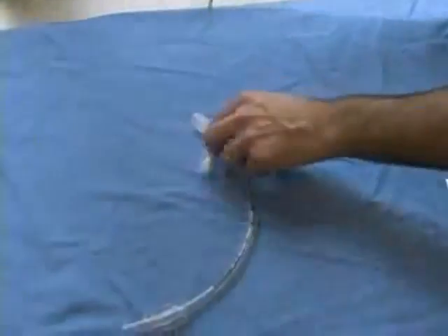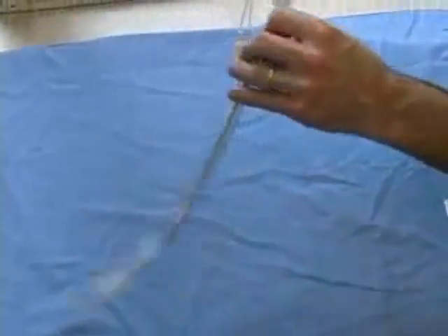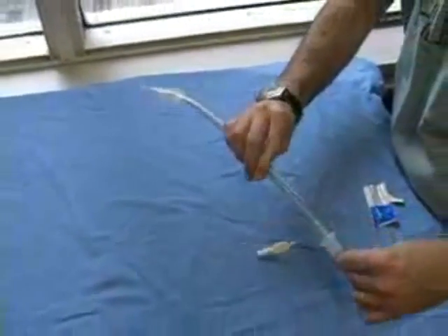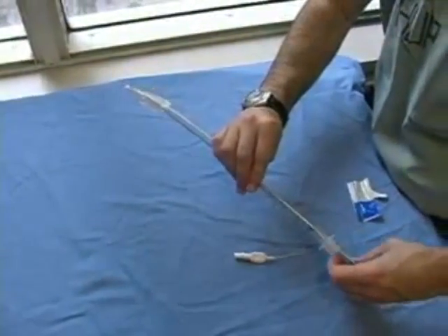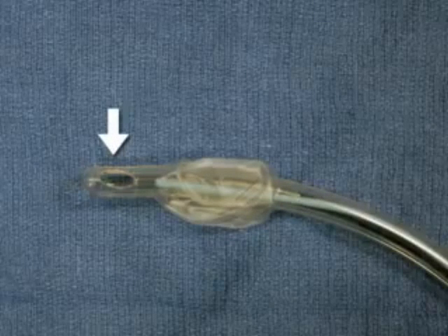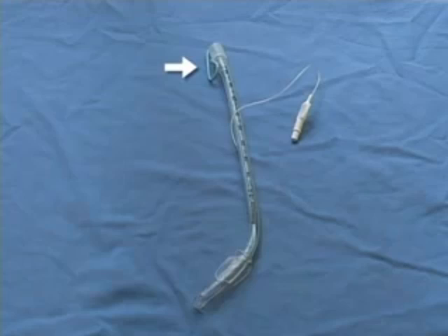If you choose to use a stylet, it should be lubricated with SergiLube and placed inside the endotracheal tube. The stylet should not extend past the Murphy eye hole of the endotracheal tube. Fold the stylet over the edge of the tube to fix it in place, then bend the tube at a 35 degree angle in the shape of a hockey stick.